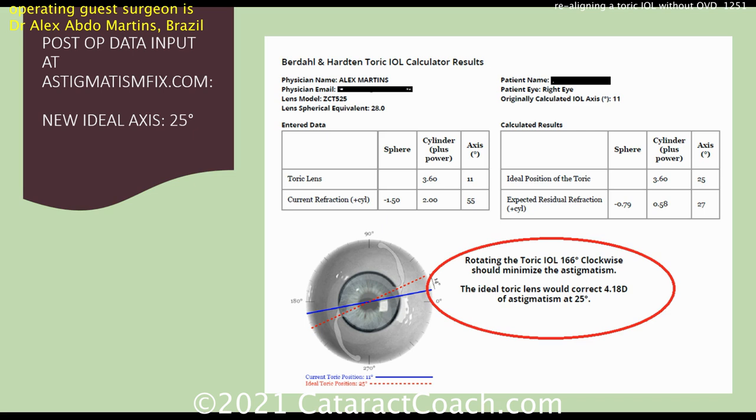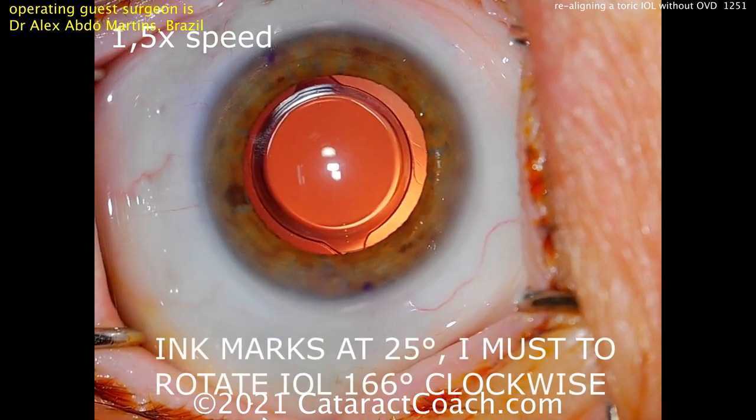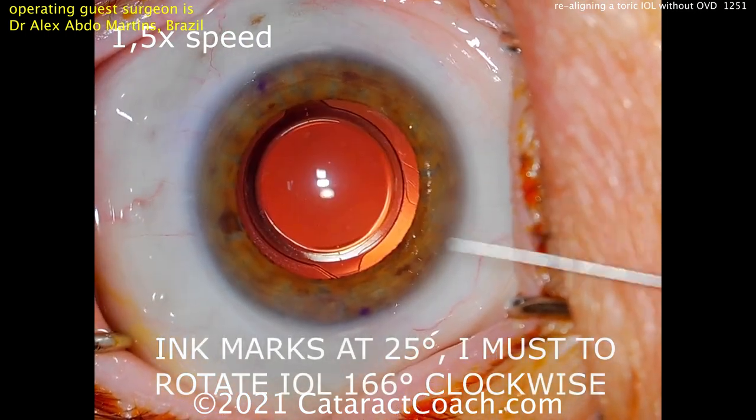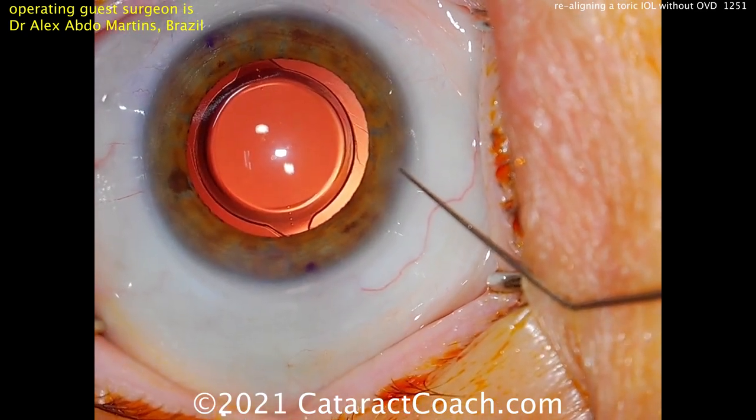Going to AstigmatismFix.com from Jason Berdahl — smart man. It says rotating the toric lens a little bit clockwise should minimize the astigmatism. The ideal axis is a little different. The ink marks are at 25 degrees and he wants to rotate the lens.